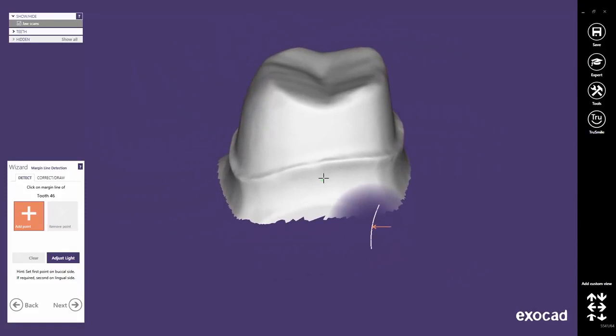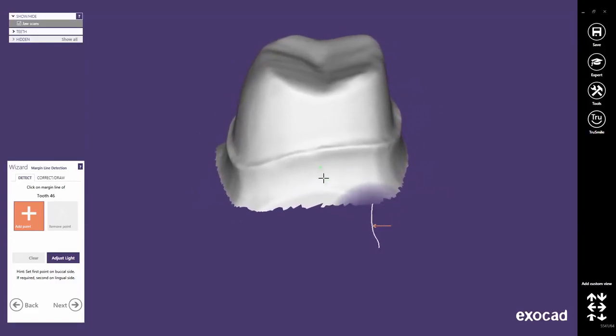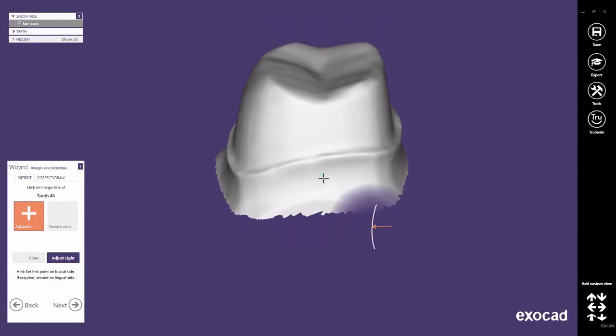Alternatively, you can use the cursor keys to pan the view. Click the mouse wheel or middle mouse button to center the point you choose, and define this point as the new rotation center.